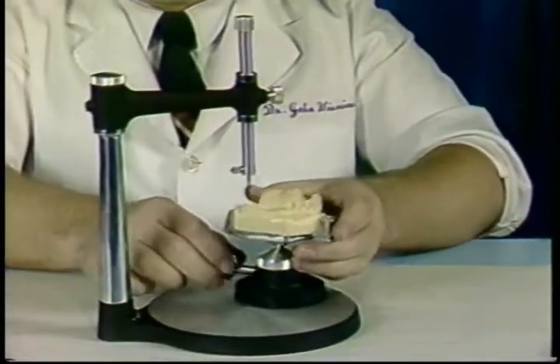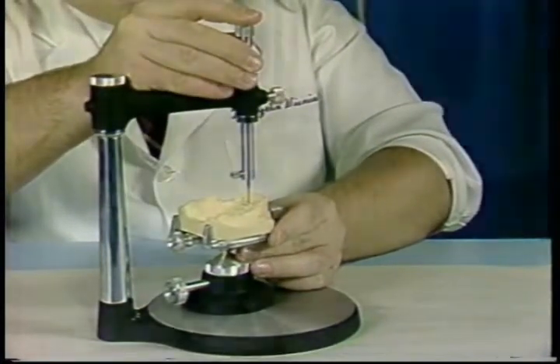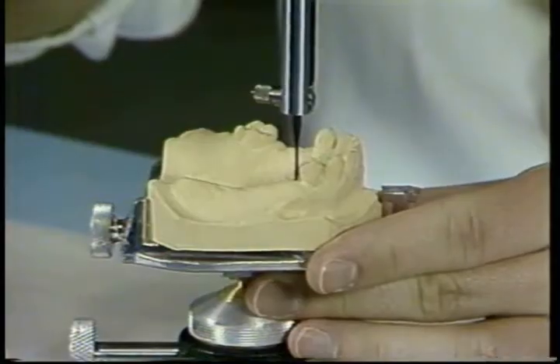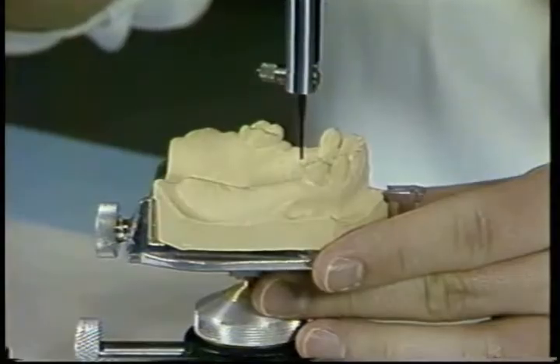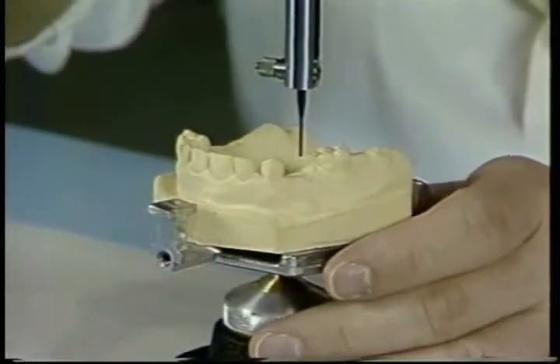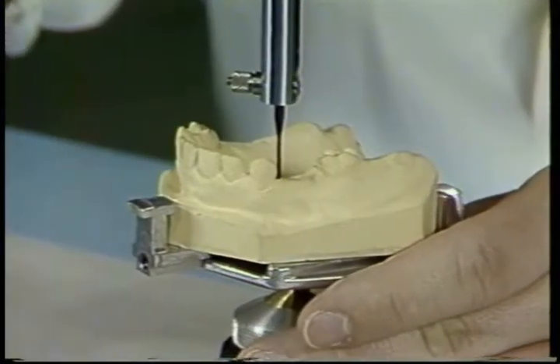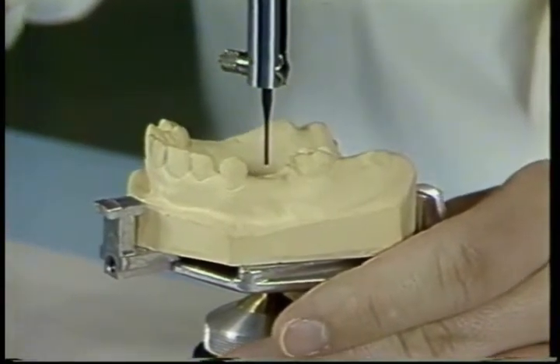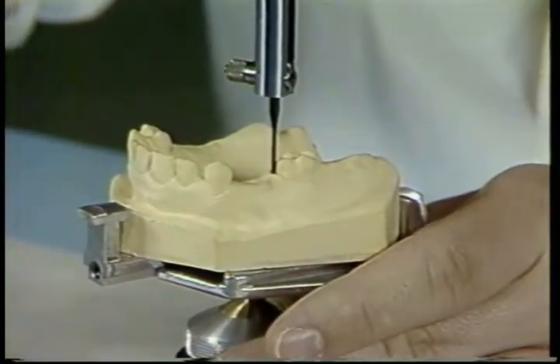Examine the proximal surfaces of the abutment teeth for potential guiding planes. Examination of these surfaces can give an indication of the degree to which the surface must be modified in order to achieve parallelism of these abutments.